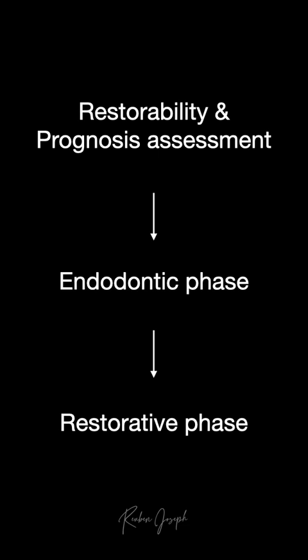During the endodontic phase, I remove caries only enough to go ahead and initiate my access cavity preparation, clean, shape the canal, disinfect it and obturate it. Then I move into the restorative phase where the caries removal is far more complete, and then I plan my post-endodontic restoration. Let me explain why this might be a good order of things to follow.